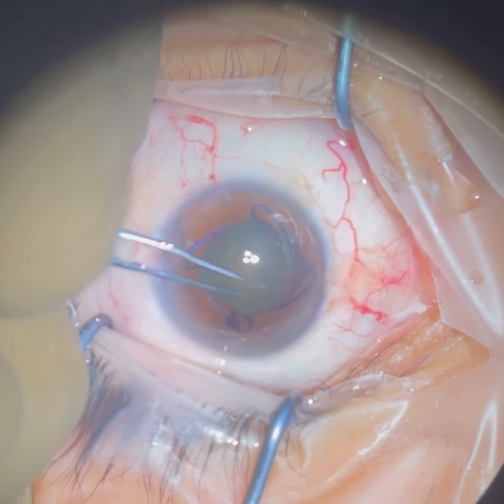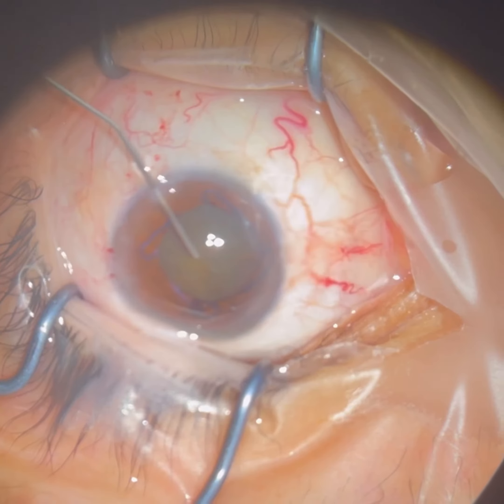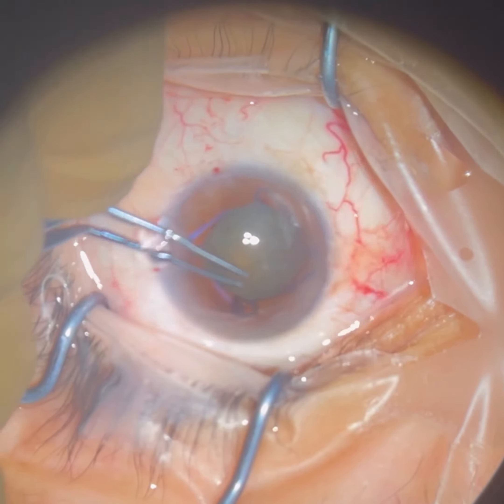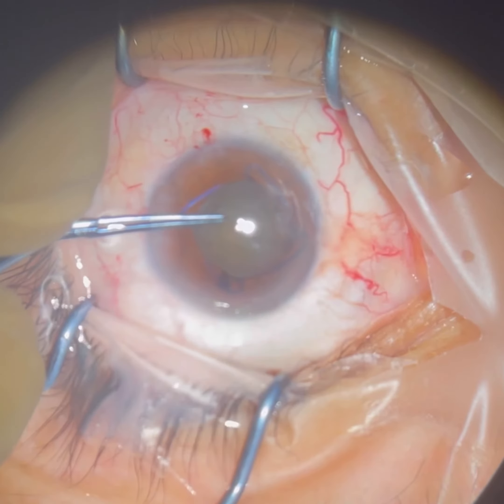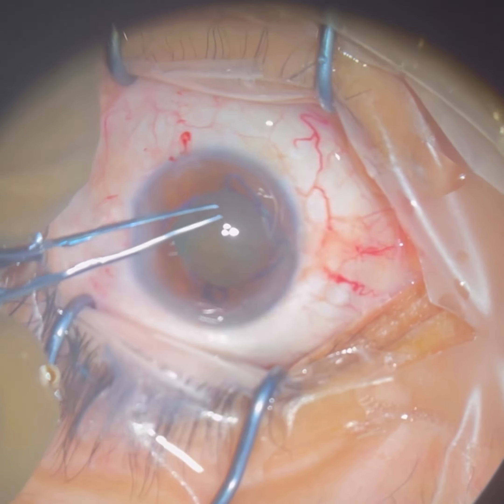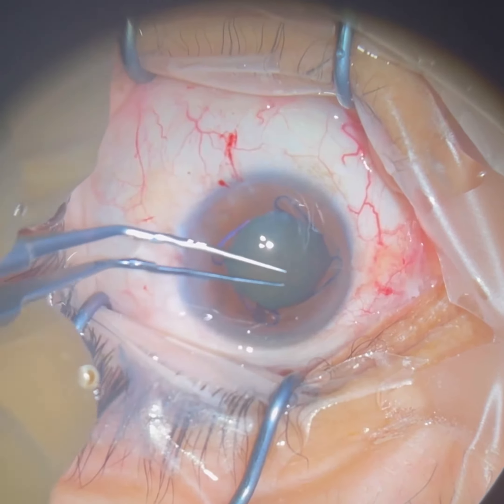The next step here is to open the capsule of the cataract. We're removing the top layer of the cataract so that we can access the cloudy lens, which is this kind of dark gray-green material that you see.